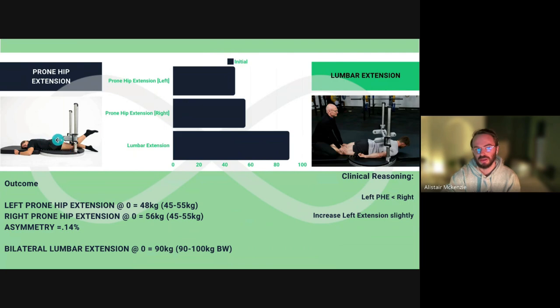So I'm still looking at posterior and anterior, and now I'm looking at them combined a little bit more, one limb to bilateral. We don't actually have enough data on this, I believe, to know trends, but it's something that we're going to look into.